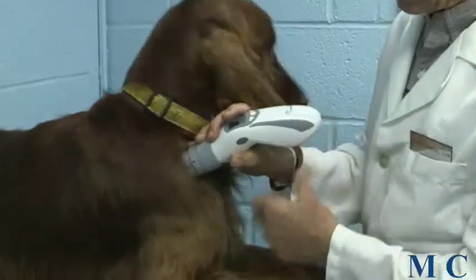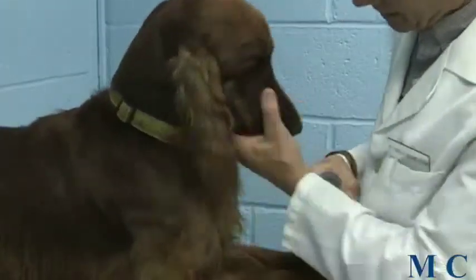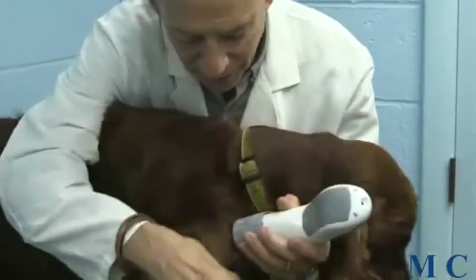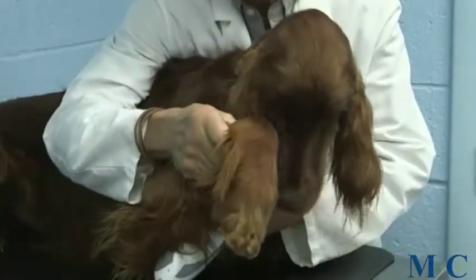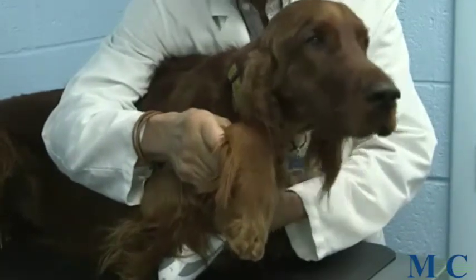We would then move on to his next lymph node, which would be his axillary lymph node up under his front leg. That's going to be a little bit difficult to demonstrate, but if he lets me lift up this front leg, his axillary lymph node would be treated right up under the armpit of the front leg. There's a plexus of nerve and blood vessels there, so it's easy to treat.